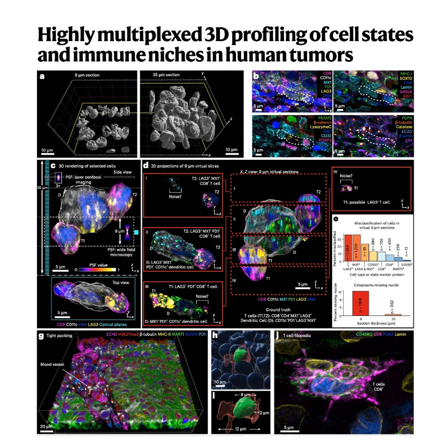Okay, so historically, medicine relies on these really thin sections, typically only 4 to 5 micrometers thick. Just to give people a sense of scale, how thin is that, really? Well, think about a single human hair. That's maybe 70 to 100 micrometers thick. So these medical slices are 15, 20 times thinner than a hair. Incredibly fine. And this tiny sliver is then used for everything. Your standard H&E staining, the basic look, all the way up to the most cutting-edge spatial proteomics methods people are developing now.